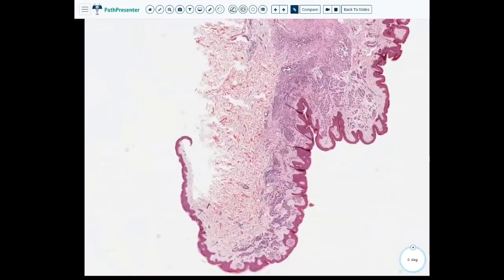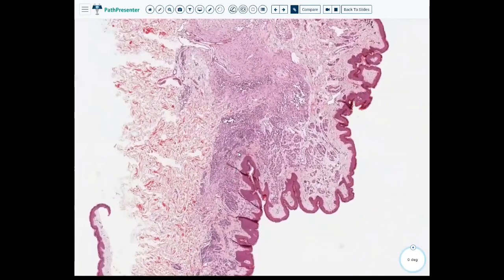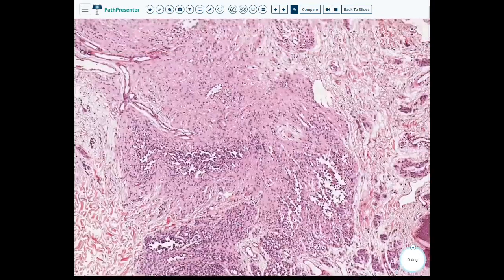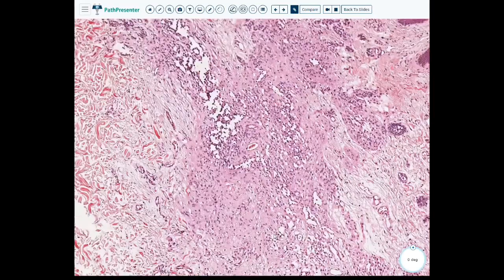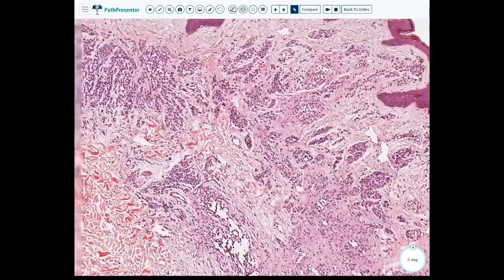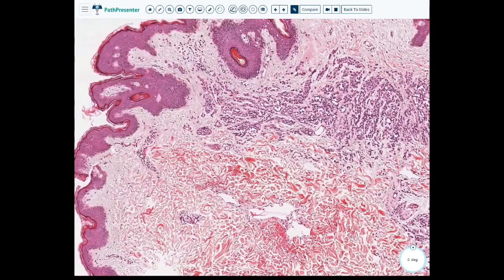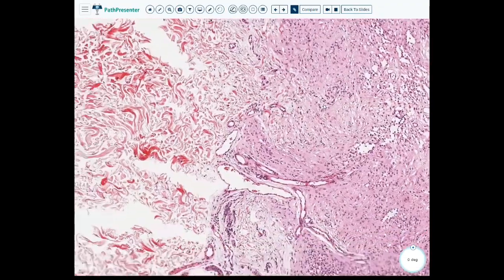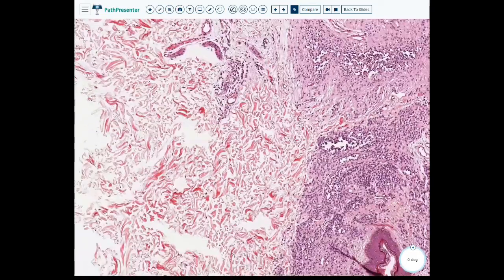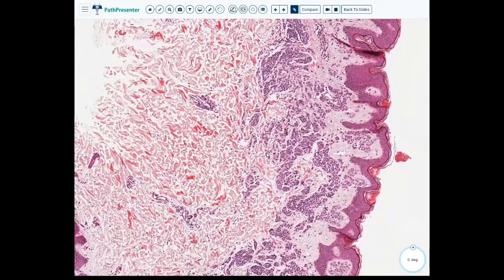And kind of the same thing over in this piece where we can see that we have this very extensive dermal component of this nevus, but no extremely prominent adnexal structures. So this is still a congenital nevus, but besides the vessels and the depth, I thought this one was pretty difficult. Maybe that one hair follicle.